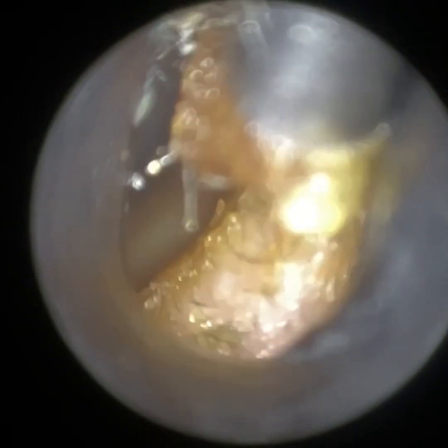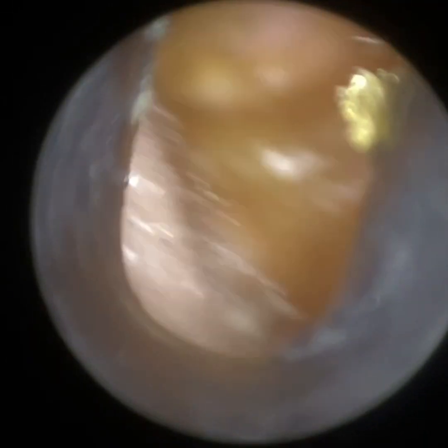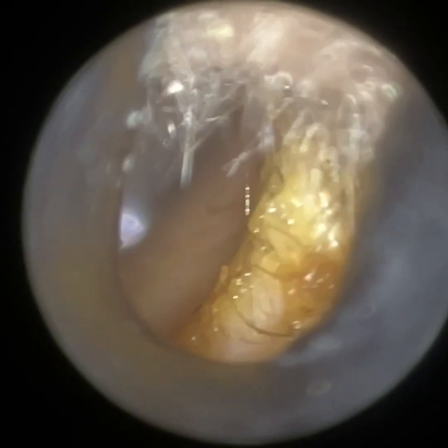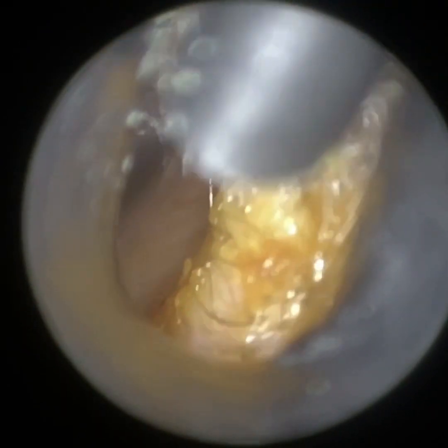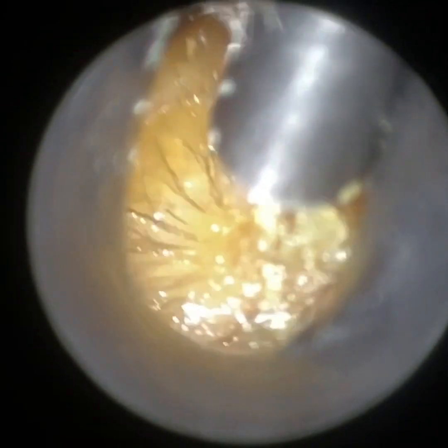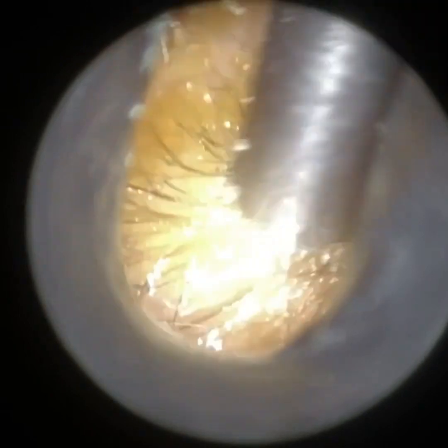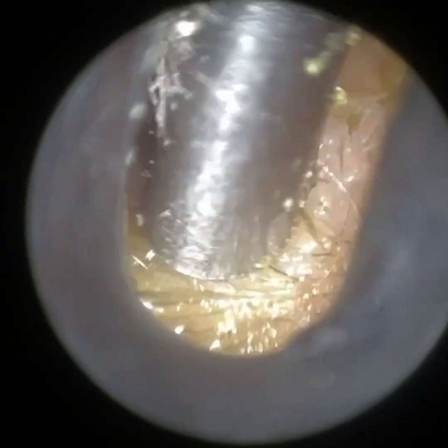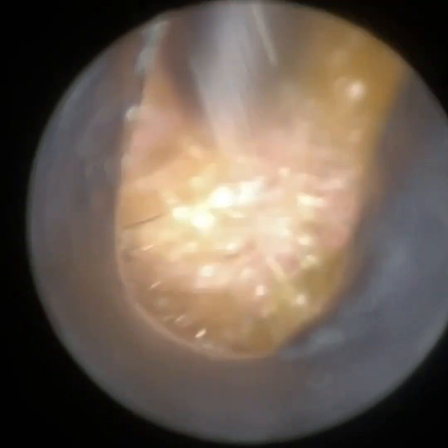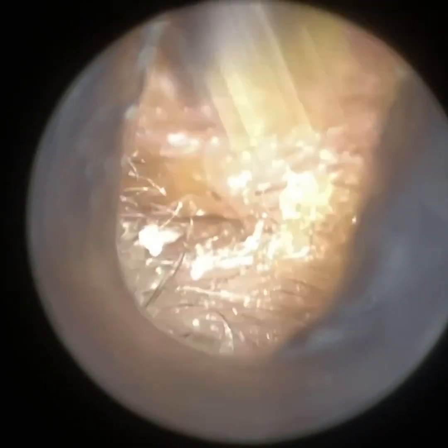I'm just gently mopping this away. The cartilage was quite thick and quite rigid, so even to stretch the ear out with my hand prior to inserting the speculum was quite a task. It wasn't a weak cartilage — a very strong, sturdy cartilage — and it was very difficult to lift back and retract upwards in order to straighten and widen the canal.